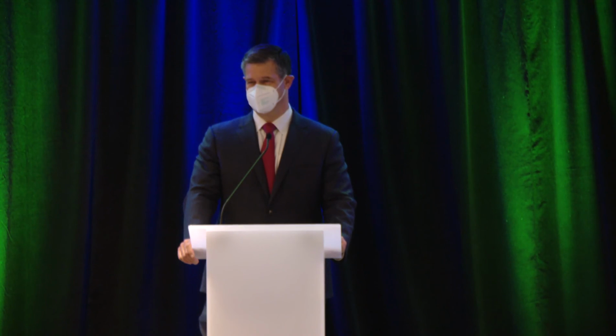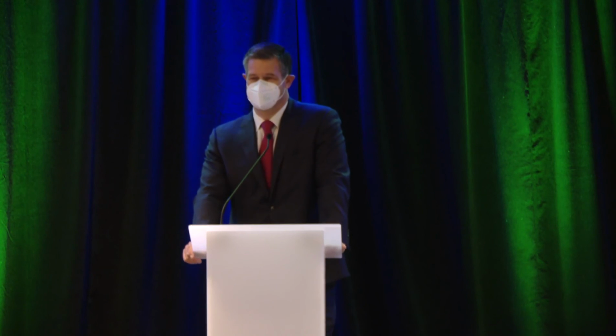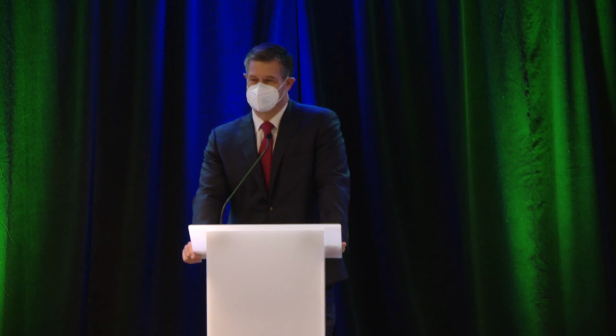Let me make one comment that we're not emphasizing about the motility study. All of us know this in the lab. The reason we can interpret a motility study well is if our nurse does a good job. So when you see this scenario that Raina talked about, putting the tube down, letting the patient settle down for a minute or two, then doing your LES measurement and all of that, that doesn't happen most of the time.